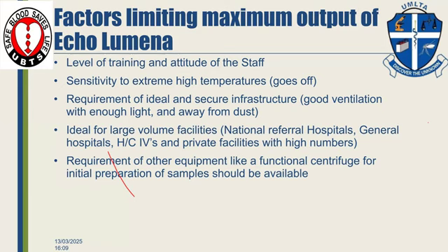Then another issue is that the equipment requires other functional equipment like a centrifuge, because you first centrifuge that sample before you load it in the machine to continue the procedures.